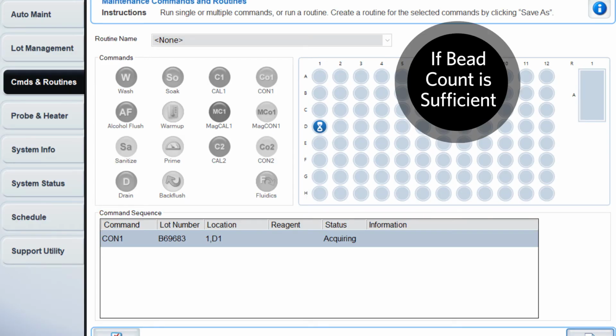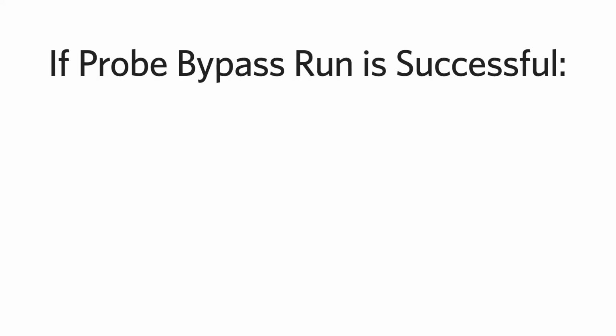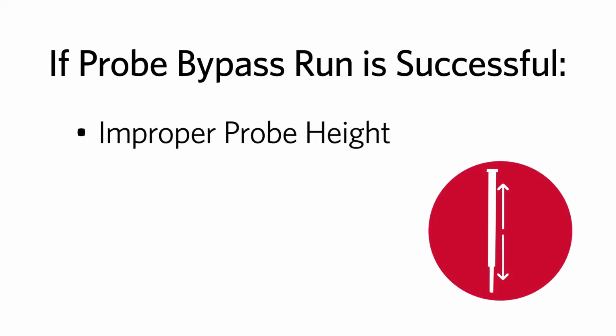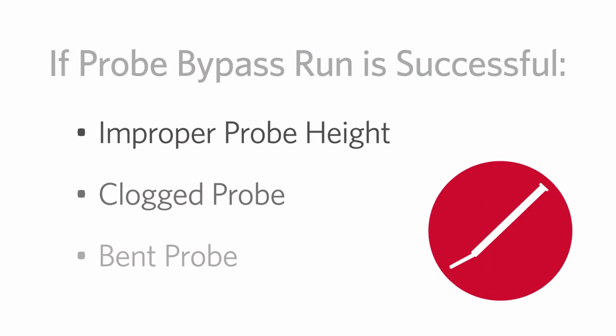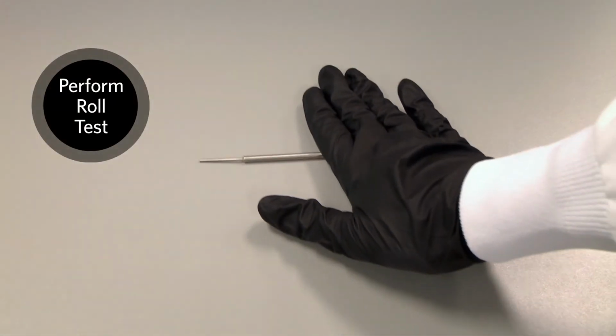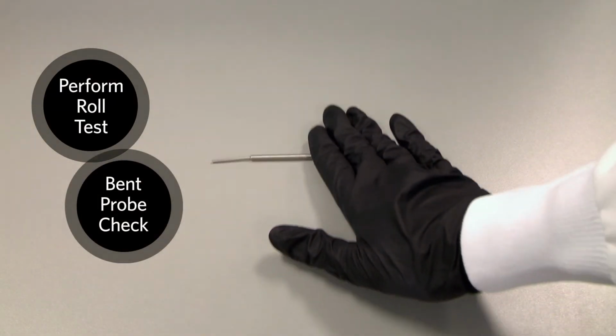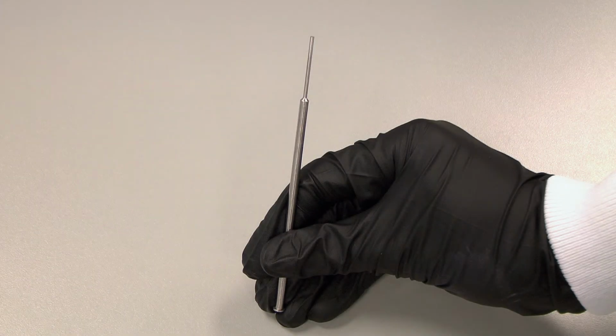If the instrument counts a sufficient number of beads and the xPONENT command runs successfully when sampling directly from the sample line, the problem was either due to improper probe height, a clogged probe, or a bent probe. Remove the probe from the instrument and perform a roll test to check for a bent probe. If the probe is bent, replace with a new probe.